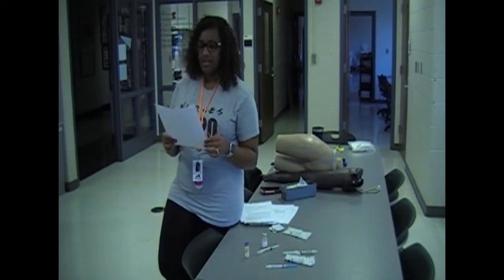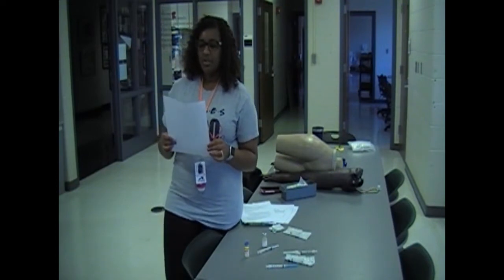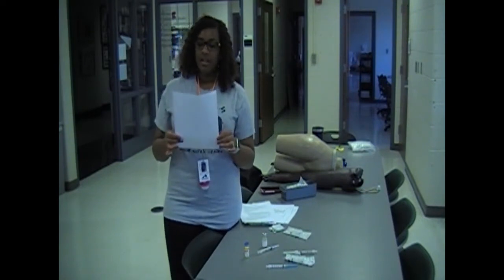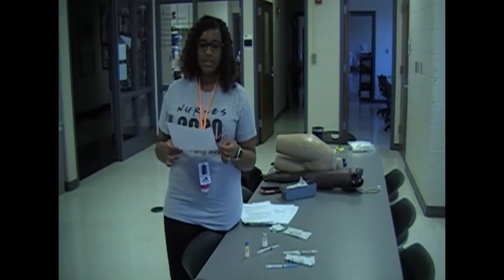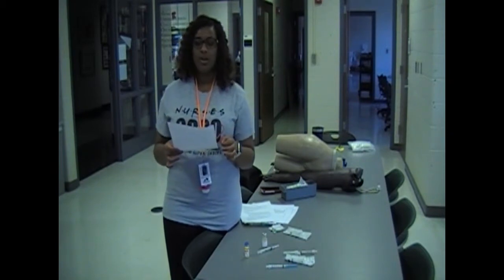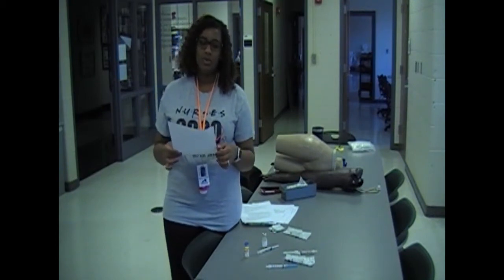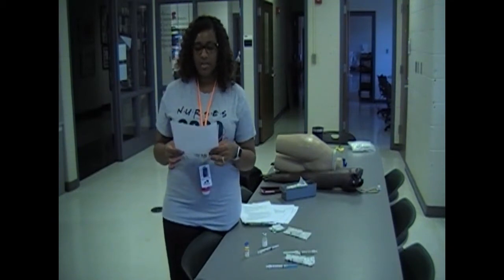Alright, as always, you have to remember to always follow the 6 rights of medication administration. The right drug, right dose, right time, right route, right client, and the right documentation. For video purposes, we will have a physician's order for you and a MAR. You can just verbalize that you have checked your MAR against the physician's order, but you will have one. If you want to actually do it in your video, that is okay too.